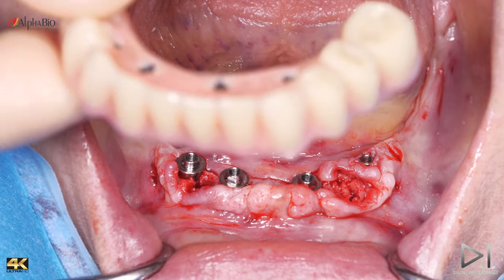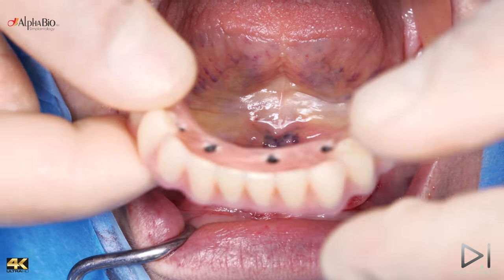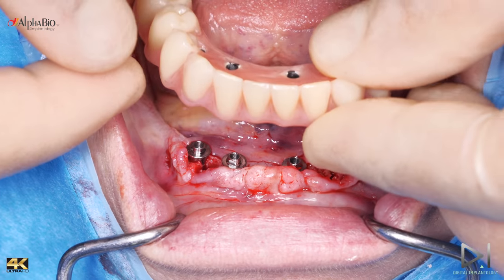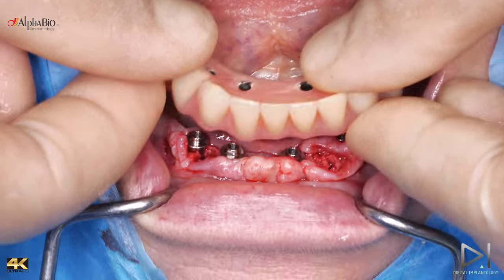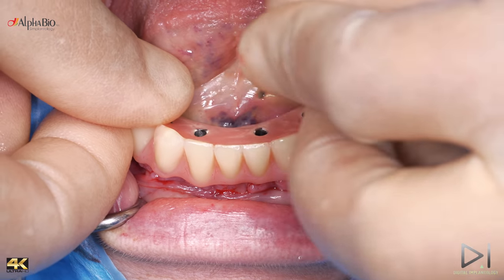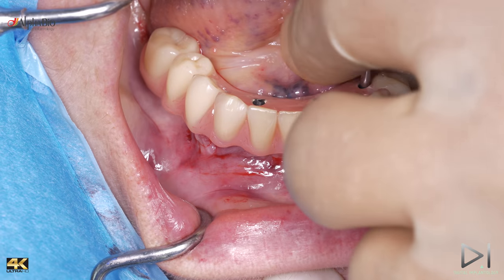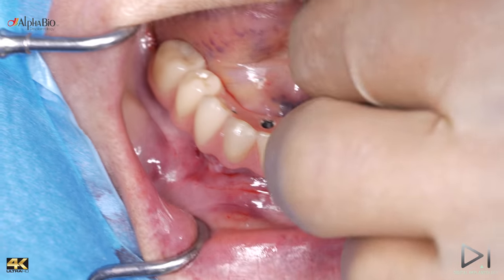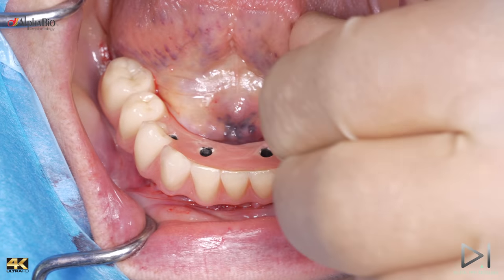We have to try the bridge now. This is the moment — in the center of the skin, and we try it. We have to find the right position over the skin.